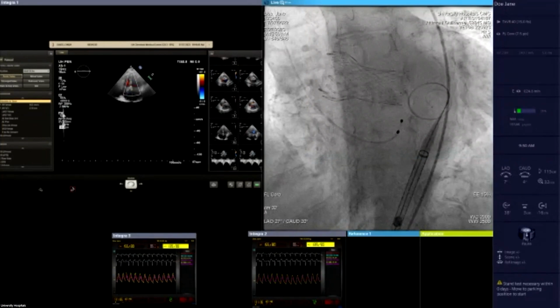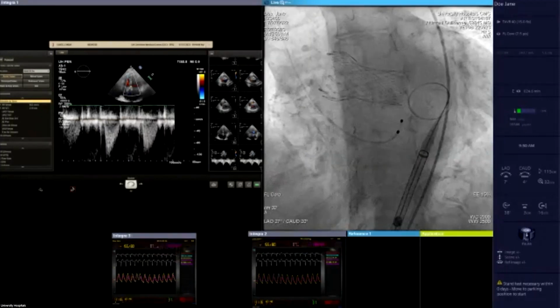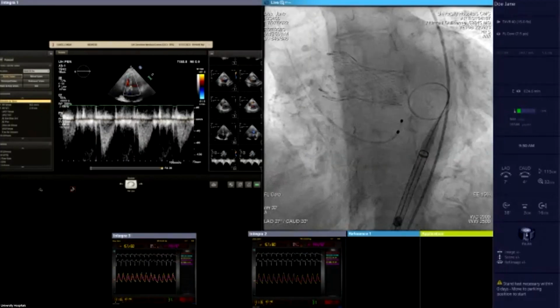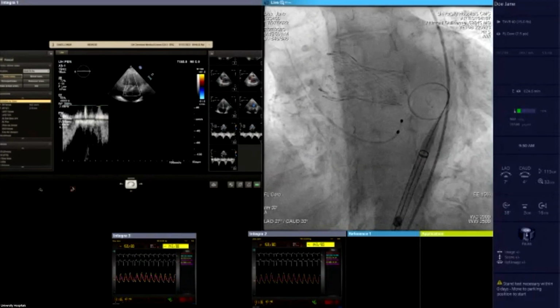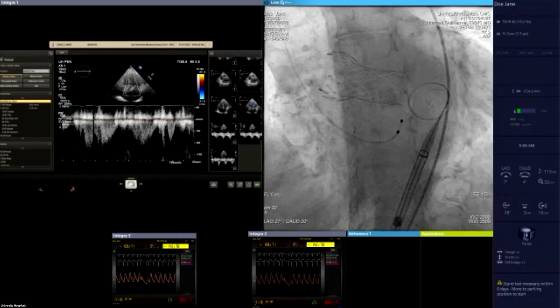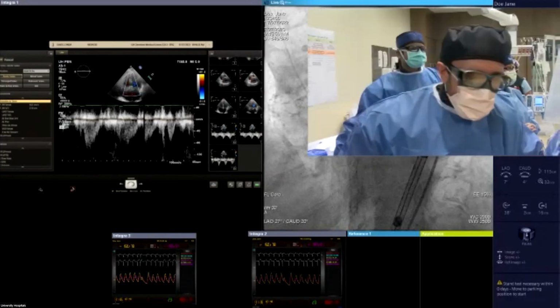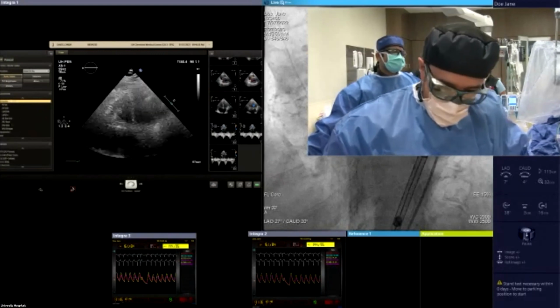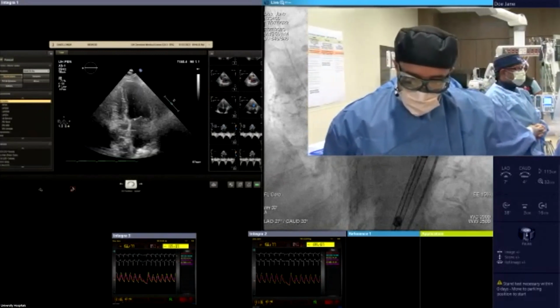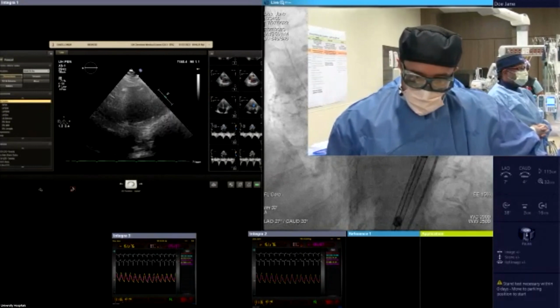So first of all, we make angio from the system, and if everything looks nice, then we go forward. Did you perform this? You do what? I could not hear you well. You do what? Angio what? We just make angio from the prosthesis, to see how it looks.